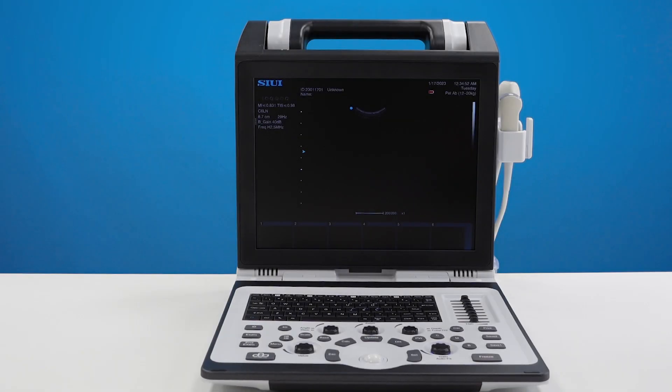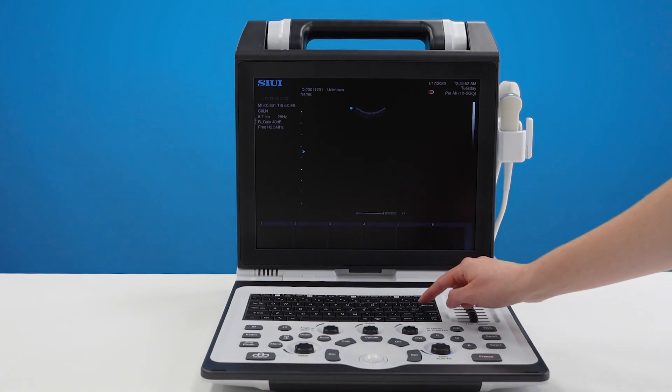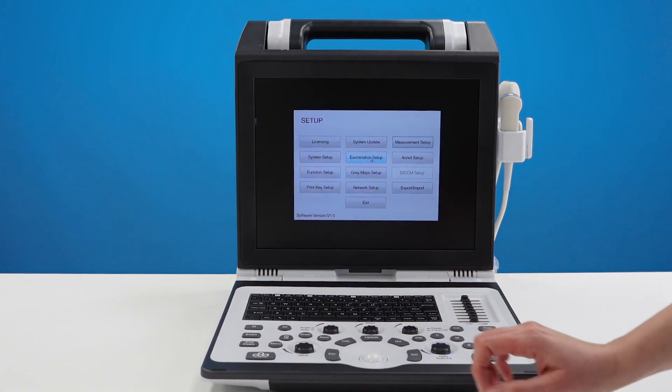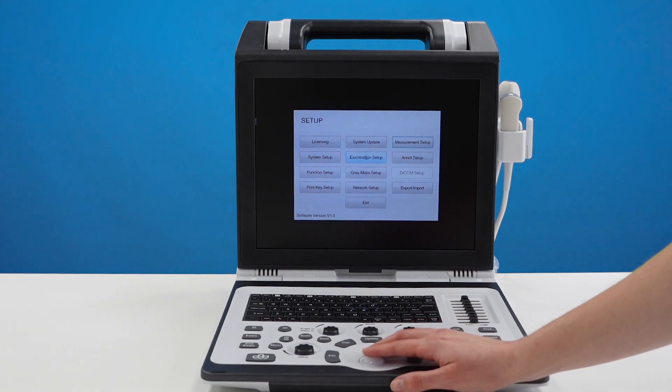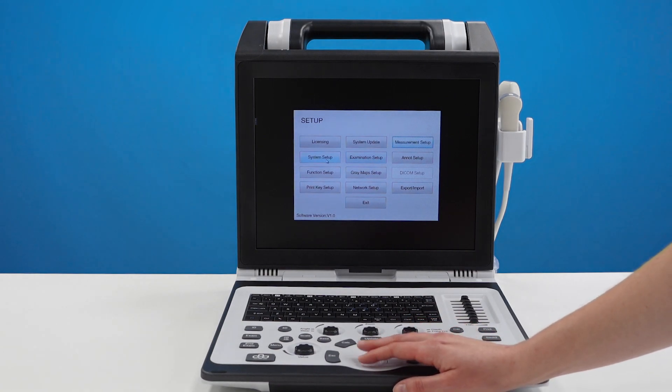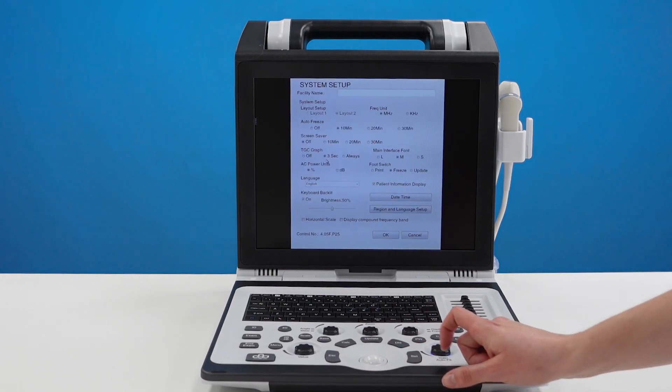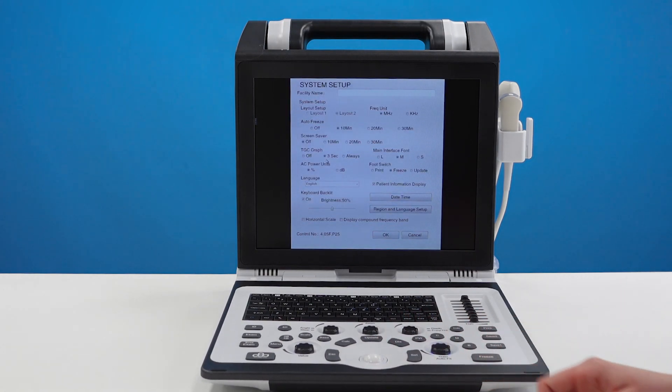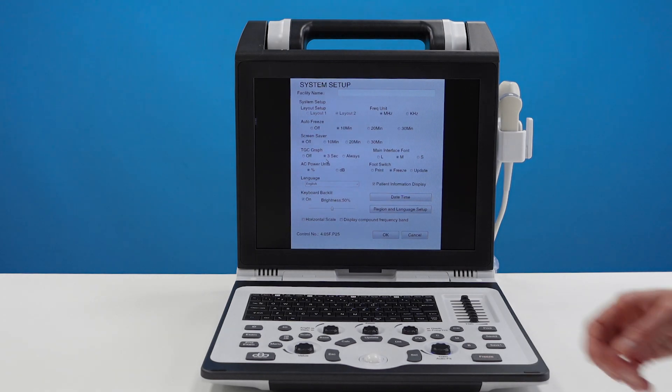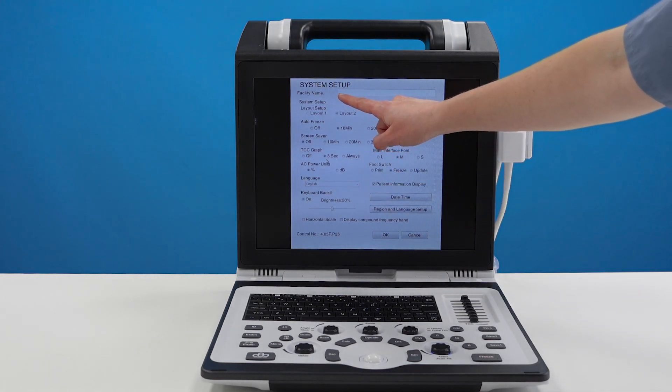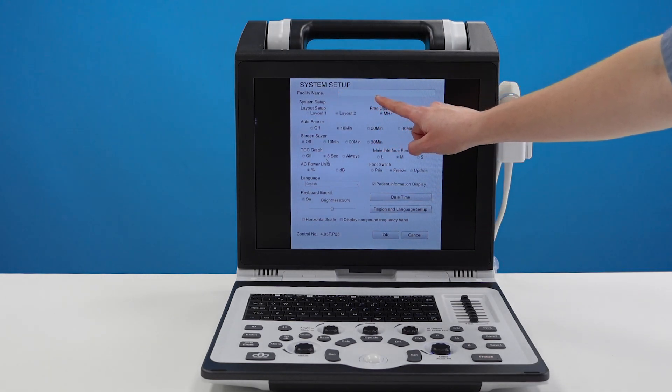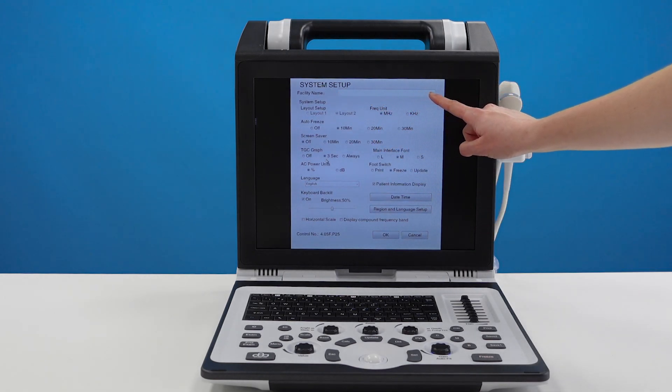When starting this machine for the very first time there are a couple of things you might want to do to get started. Press the setup key and move over to system setup and press set. Set is like your enter key. Here you can put your hospital or practice name.